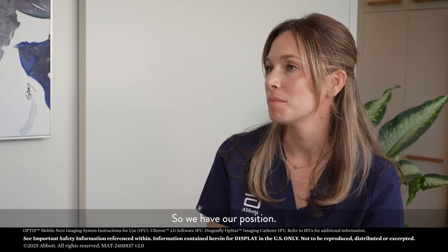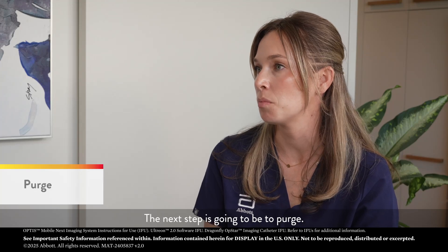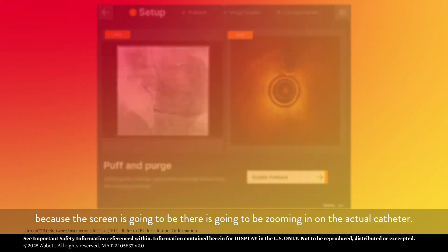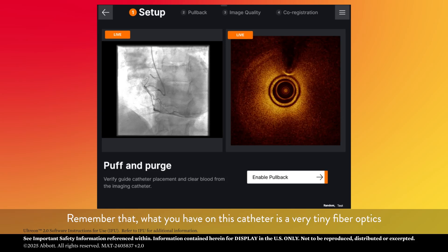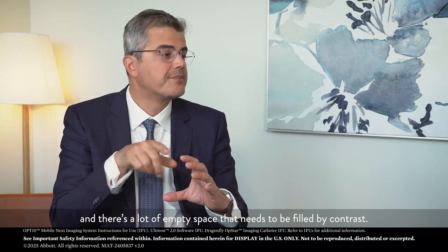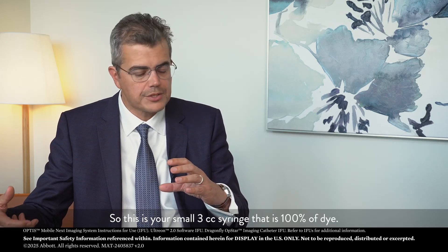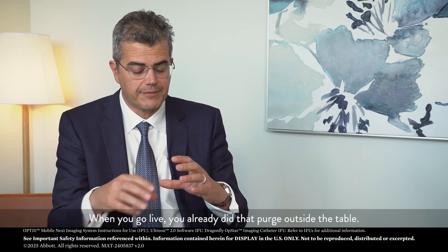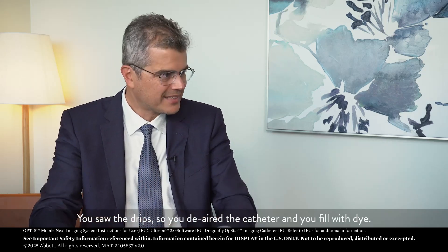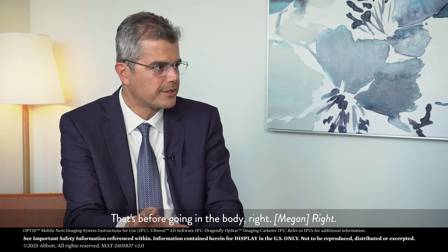Now that we have our position, the next step is to purge. The software makes it easy because the screen is going to zoom in on the actual catheter. The catheter has a very tiny fiber optic and there's a lot of empty space that needs to be filled by contrast. This is your small 3cc syringe that is 100% dye. You do that purge outside the table, you see the drips — you de-air the catheter and fill it with dye before going on the body.